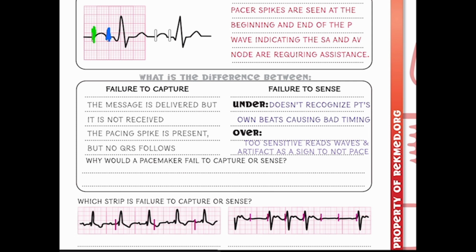So why would a pacemaker fail to capture or fail to sense? We can have a number of issues here. So there could be the wrong voltage or sensitivity. We can also have improper positioning. We can have battery failure, or there could be that poor connection. Meaning it could be programmed or positioned within the cardiac chambers wrong, and there could be a potential battery failure on the pacemaker or poor connection.